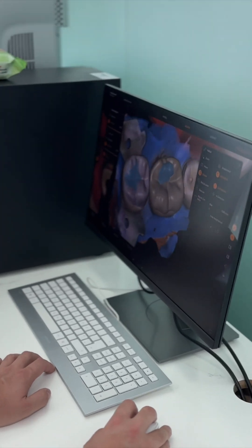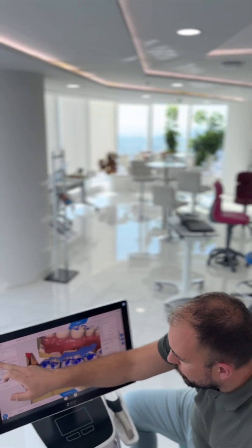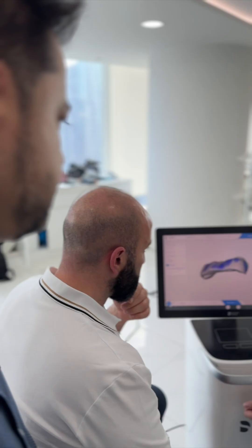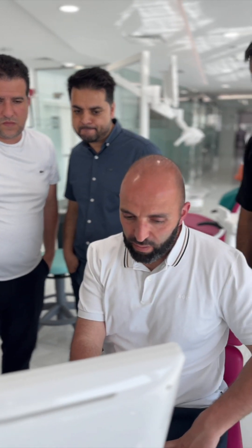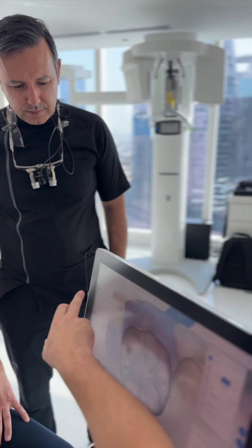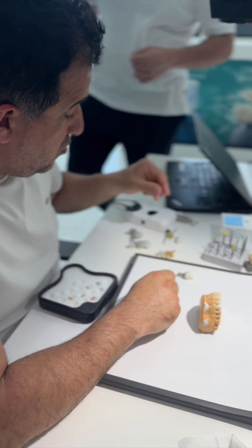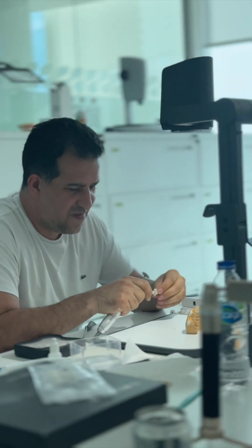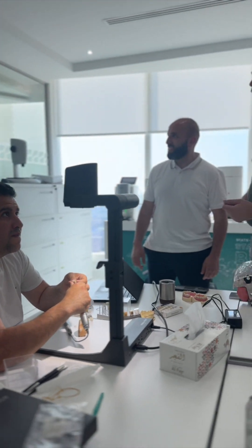This is what I want. For example, we do it without the lower like this. So it's not concave, it's convex now. Restoration contacts — no need. This is the anatomy. Then we check with the lower jaw — is everything okay? Maybe a little bit. Flip the crown the other way around and check the line and the angle. You see the line of the restoration.